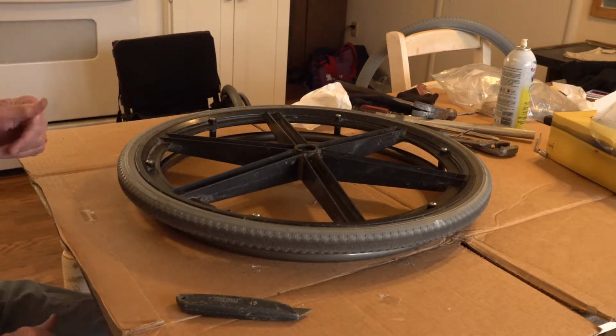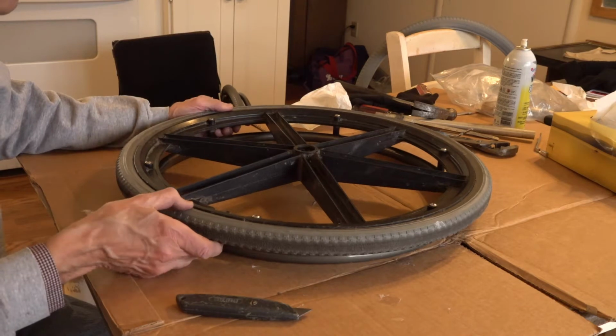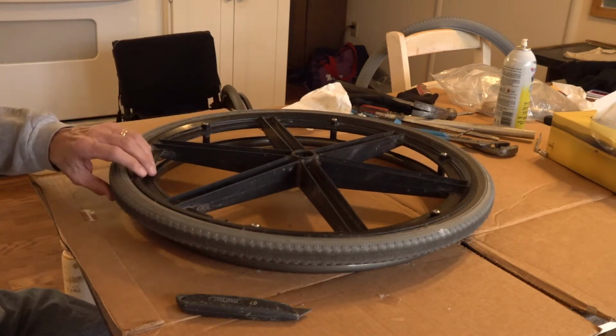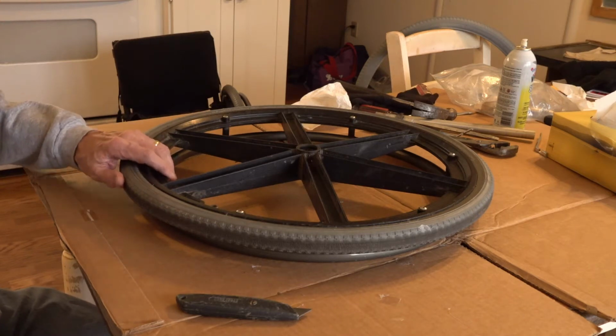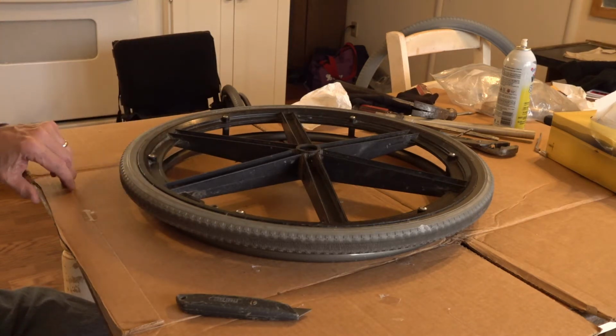Wheelchair here with the wheels are standard pneumatic wheels with a solid core insert on it. And our task today is to change the tires.